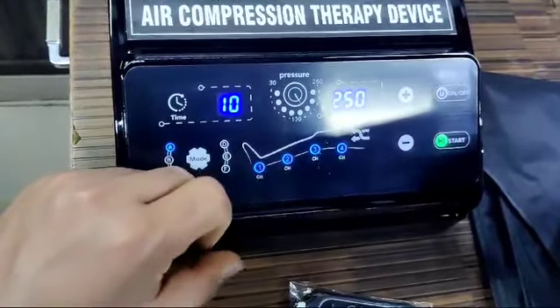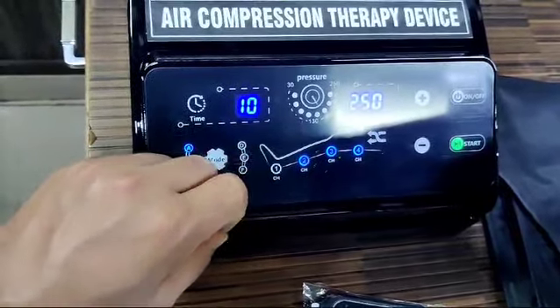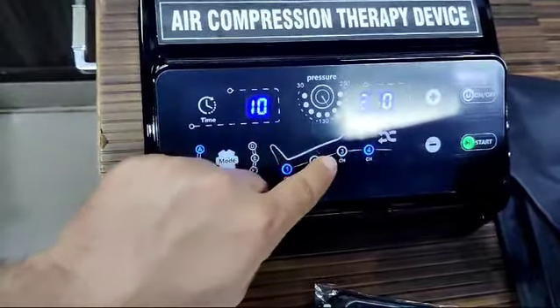All four chambers are switched on, as indicated by the blue light. If you want to switch off a chamber — for example, chamber one — you can switch it off or switch it on by touching the panel.